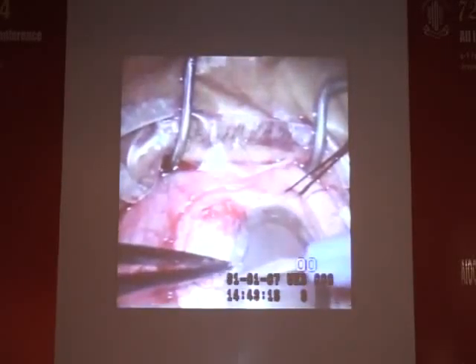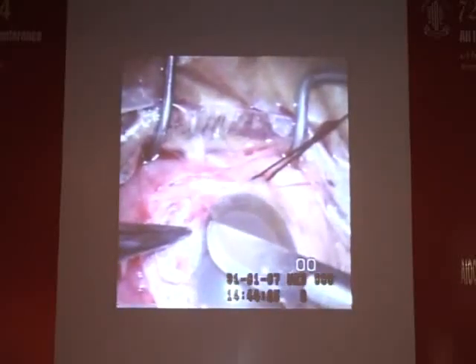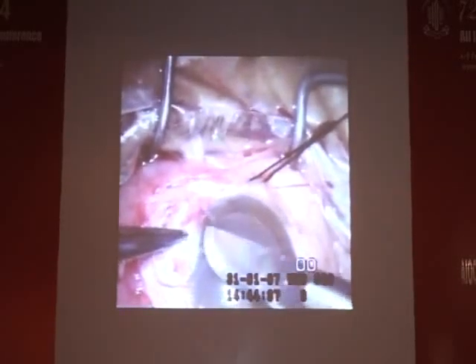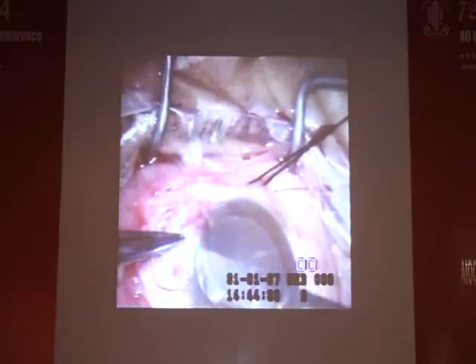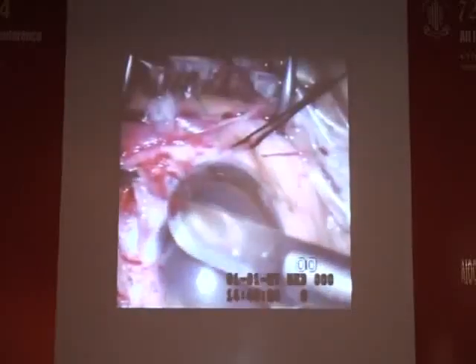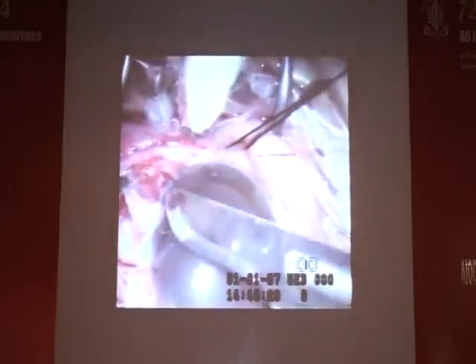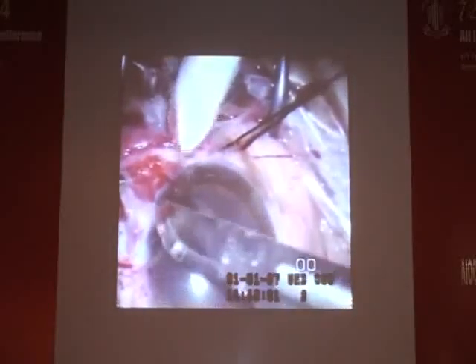And once you've got the correct plane, you can do this multiple times, of course, as well. Here the idea was to avoid penetrating into the anterior chamber because this was a fungal infection in the periphery, and you just keep going deep until you get well underneath the infected part, and then you go out into the sclera as well, where you can create a nice 6 millimeter bed.